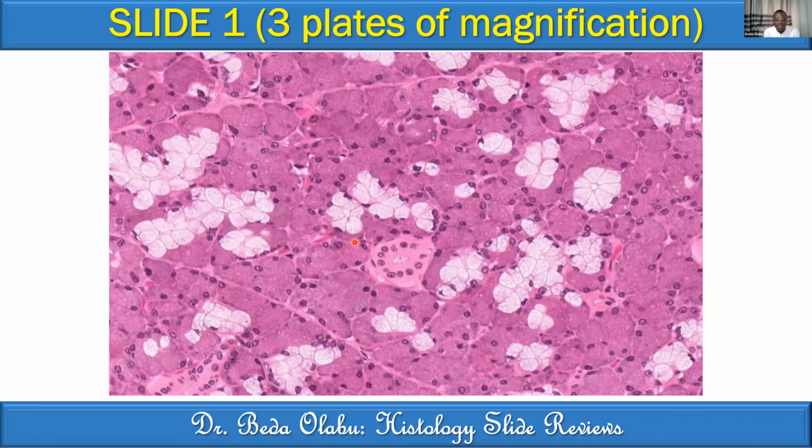But again, in the lobule, we see organization into acinar morphology with the mixed acini. So we have serous acini, the ones that take up stains, and mucus acini, the ones that do not take up stains. So we confirm that the parenchyma is seromucous or mixed type. And I'm happy that the people who have spoken have picked that this is therefore not an endocrine gland, but an exocrine gland based on the things you've seen.